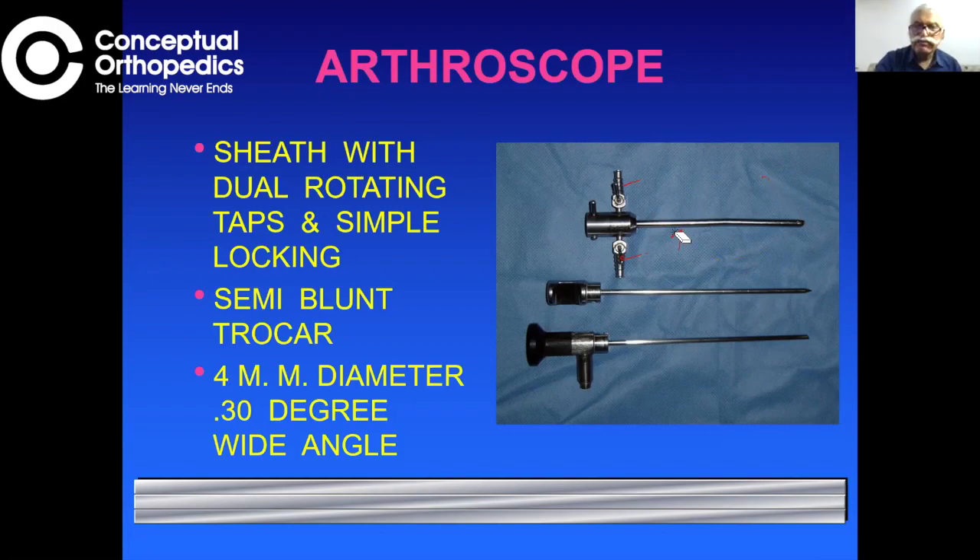To introduce the sheath at the beginning of a procedure, you need a trocar. Currently a semi-blunt tip is used. When arthroscopy started in 1984–85, there was a sharp one to penetrate the capsule and a blunt obturator to penetrate the synovium, but the sharp trocar could penetrate all the way inside and damage cartilage. So the sharp trocar is no longer available — only the semi-blunt one, and that is what one should use.